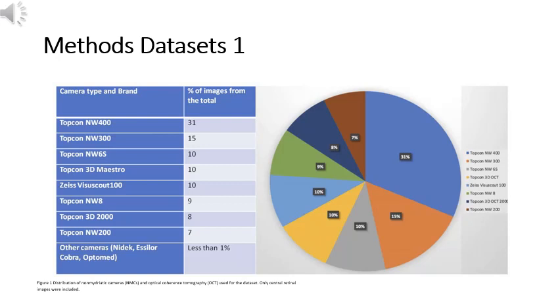The first 3 convolutional neural networks, CNNs, were trained from scratch and used for different image classification tasks. The dataset was divided by patient into the usual splits, training, 80%, and testing, 20%. 10% of the train split was used for validation purposes during the training process of the models.